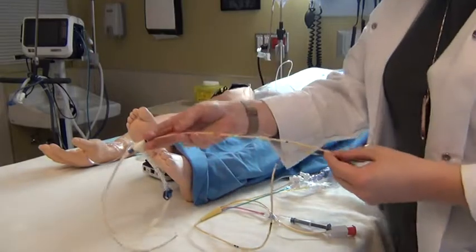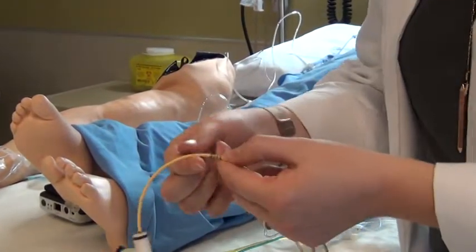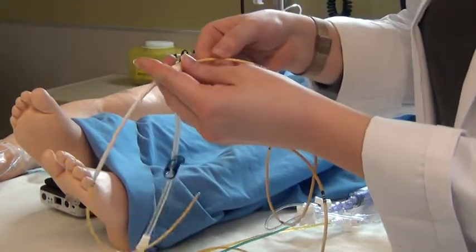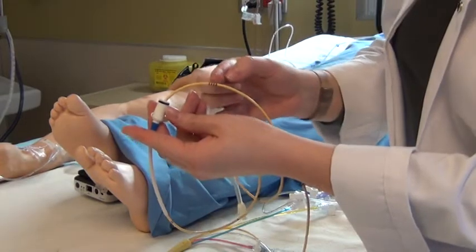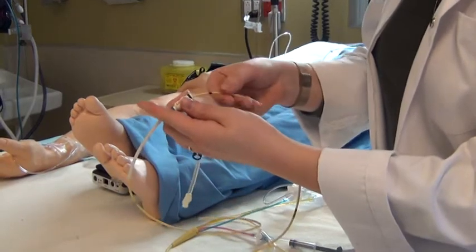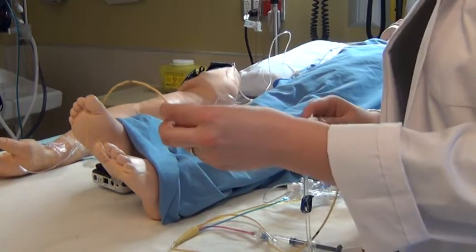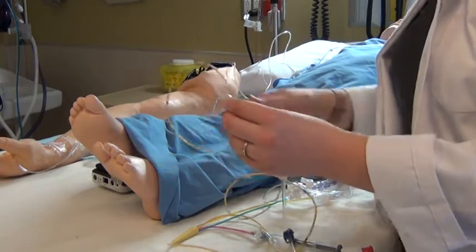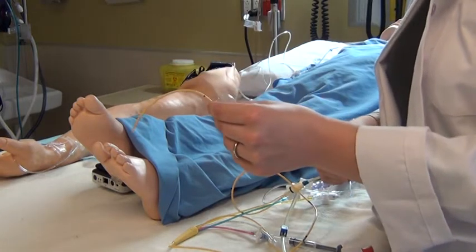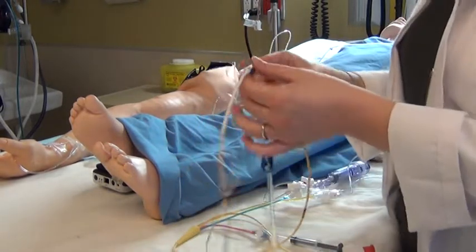There are measurements on the catheter: a thick line is 50 centimeters, whereas one small line is 10 centimeters. As they fish this device through the heart, they track measurements — at this level they're at 40 centimeters, continuing to 50 centimeters. They advance until they reach the pulmonary artery, then inflate the balloon at the tip; once it occludes the pulmonary artery, they know they've gone far enough and lock the catheter in place.